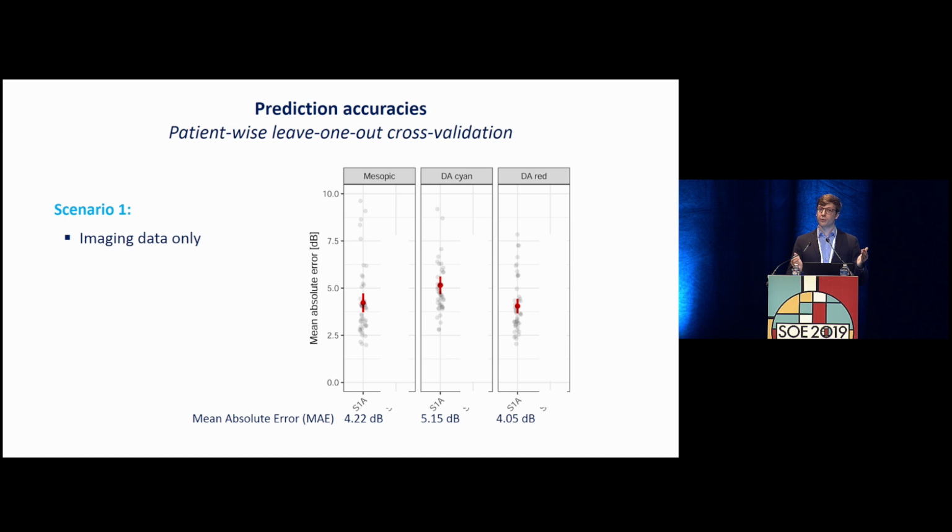And this is also almost in the same range as the retest reliability of perimetry itself. So if you repeat the exam 2 times after each other, the points will vary in about 3 to 4 decibels as well in terms of sensitivity measurements. But then again, in a clinical trial scenario, it would also be acceptable to have this predictive algorithm of predicting function on perimetry, but some patients, which you can see here slightly in gray, there the prediction was really inaccurate.